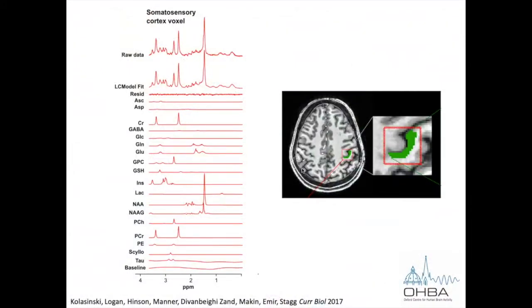It allows us to look at neurochemicals within a region of tissue. So it's exactly the same as NMR, for anyone who did chemistry. We dropped the nuclear bit of nuclear magnetic resonance when it came near people, and everyone got a bit scared about the word nuclear and human in close proximity, but it's exactly the same thing. So what we do is, you can see here, we select a region of tissue somewhere in the brain. For us, we're primarily interested in hand area, primary motor cortex, as we're interested in hand function. So almost all the examples I'll show you today are from that region, but this will apply equally well anywhere else in the brain.